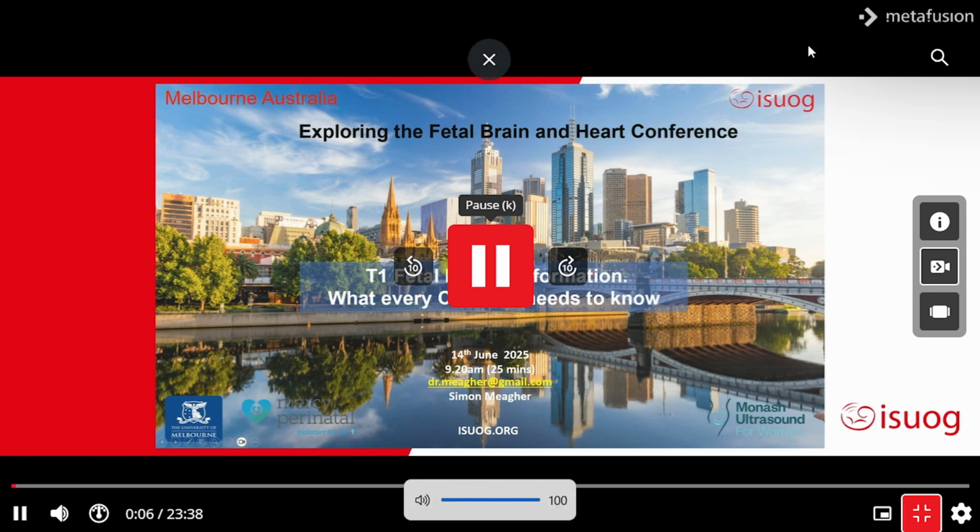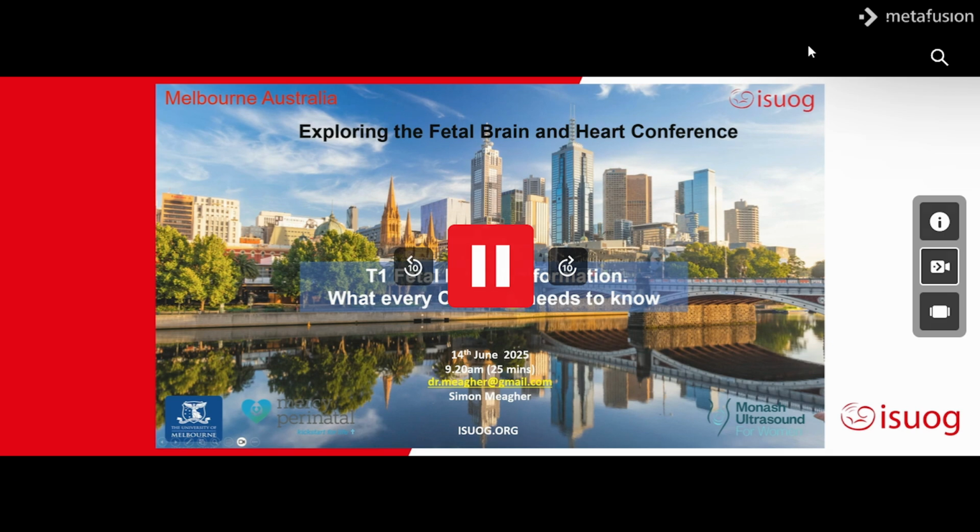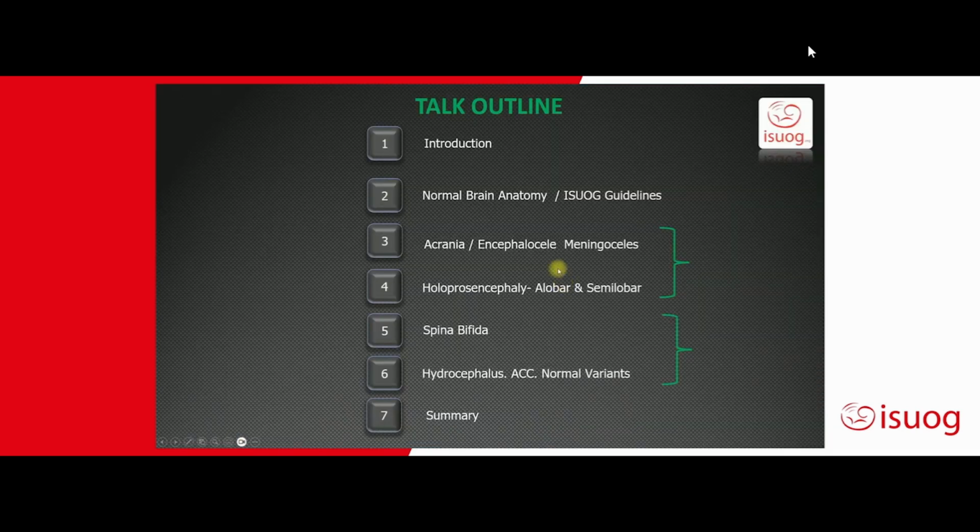Today I'll be talking about first trimester fetal brain malformation, what every clinician needs to know. The talk's divided into the following sections: an introduction, the normal brain anatomy and ISUOG guidelines. In the centre of the talk I'll be talking about the varied sonographic appearances of these abnormalities, and then finishing up with some summary and comments and some take-home messages.